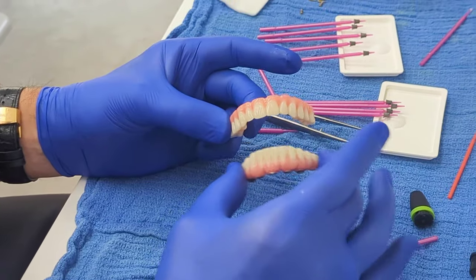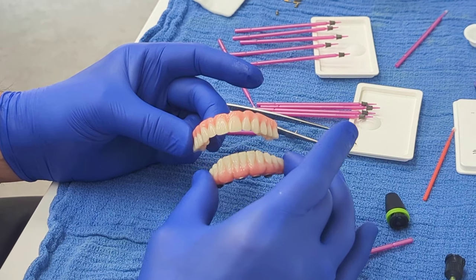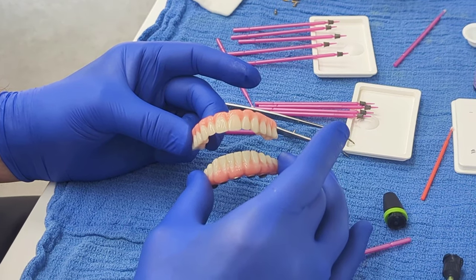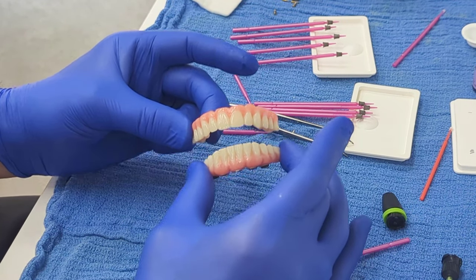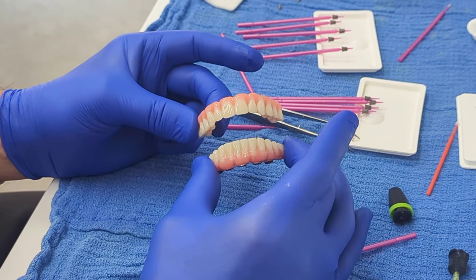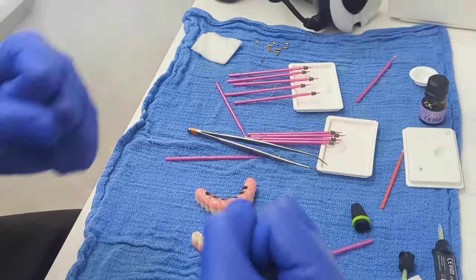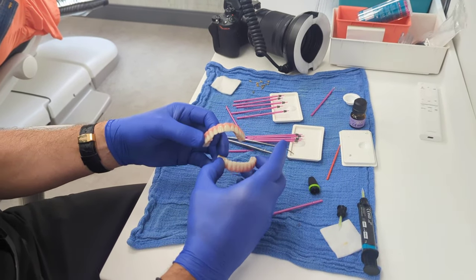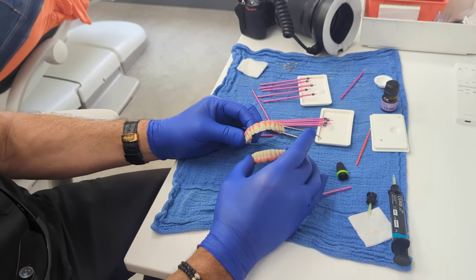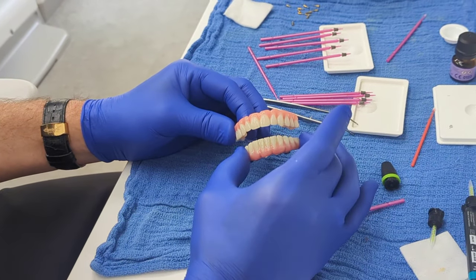When you're looking at material choices, you can go through that decision tree of what should I use and who should I use it on. If you're picking and choosing materials based on aesthetics and feel and adjustability, Gen 4 is for you or for your patient. If you're picking it based on the patient being, I call them an animal, they're just on their teeth all day long and they're clenching and grinding and really abusive to their teeth and historically have been, then you might want to actually use a zirconia restoration. Highbridge is happy to do those for you, but understand that there are the disadvantages that I've already talked about.